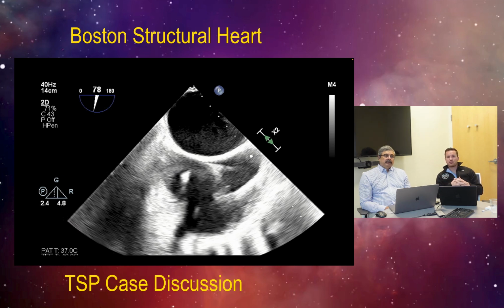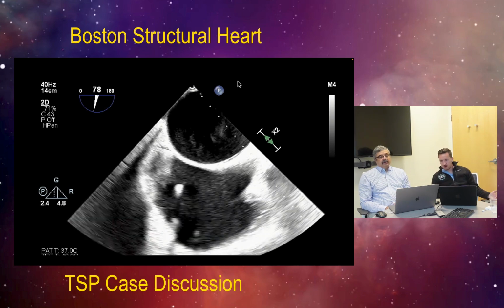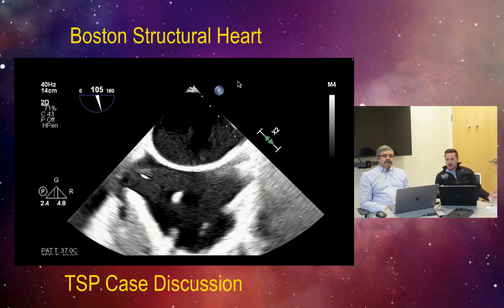We ideally wanted to not create a second iatrogenic ASD, so the level of precision required was that we actually perform this trans-septal puncture at the precise location of this patient's previous septal puncture. So I think we're going to go through a few images here. We're in the practice phase.